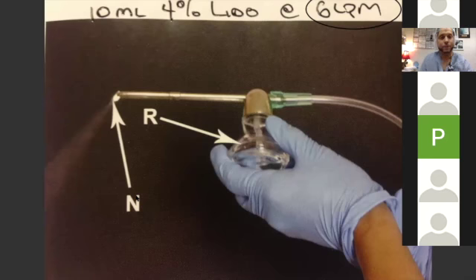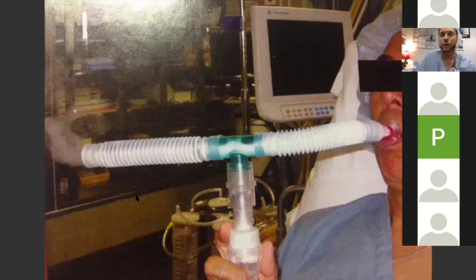Here is a nebulizer. When you nebulize, the mucosa really responds better to 4% lidocaine rather than 2% lidocaine. So that's pretty clear in the literature that 4% or 5% lidocaine is going to work better on the mucosa than 2%. And when you nebulize, and here's the nebulizer that we're more used to, you want to have the flow only on 6 to 8 liters per minute, because when you go to 15 or 10 from the Christmas tree of oxygen flow, you're making very tiny particles of local anesthetics, and they're going very deep into the lungs.